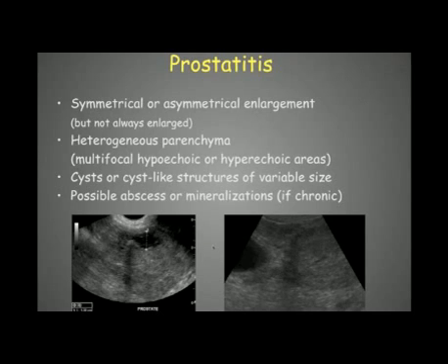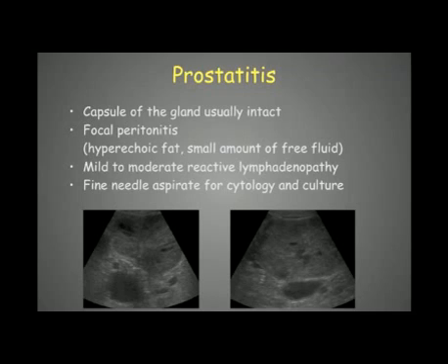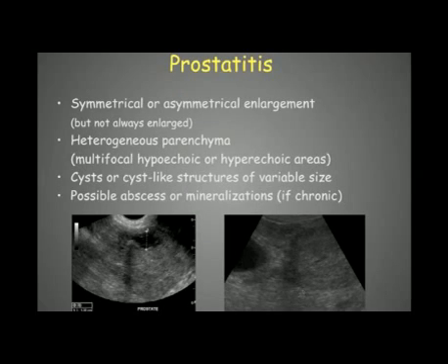These signs help us determine it is prostatitis and not just benign hyperplasia. When prostatitis begins and cysts are still small, it can still look like benign hyperplasia, so we look for other signs such as focal peritonitis — hyperechoic fat or free fluid around the prostate. Here we have free fluid encapsulated in the region of the prostate, indicating focal inflammation. The capsule is usually intact but can be interrupted, as seen here where the prostatic borders are no longer clear.